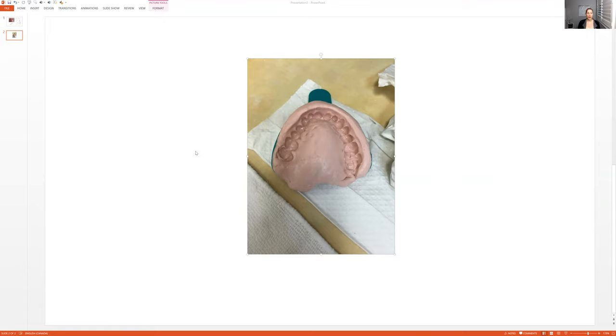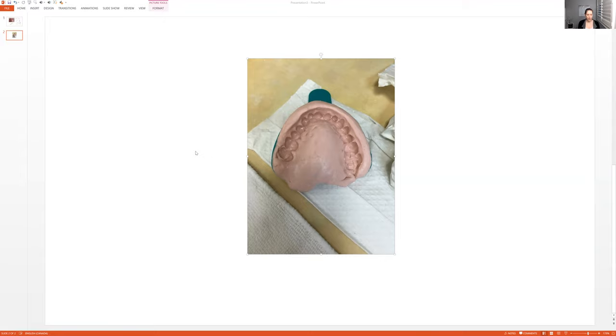Because until you're doing it all the time, you can't just look at a patient and know what size they are. So grab a couple different sizes just in case, upper and lower. Yes, you might have a lot of different trays in there. You might try them in. And then the last tray you happen to try in fits the top and the bottom. So you might have to sterilize a lot of them. But whatever, that will take time.